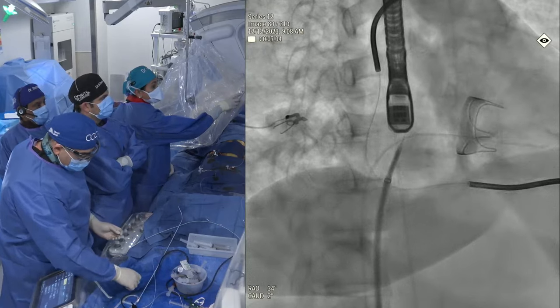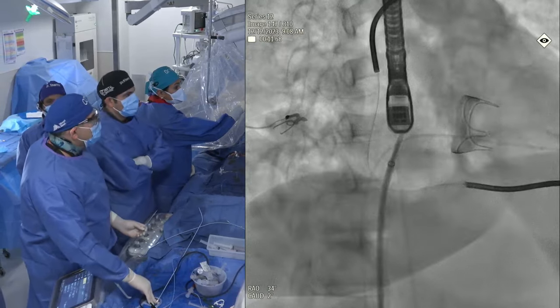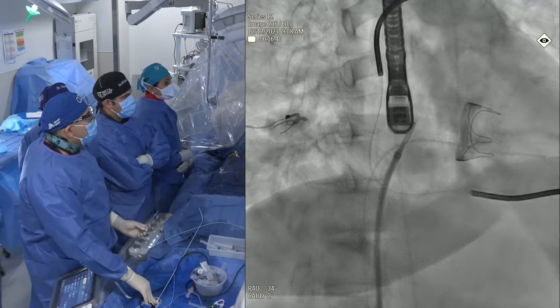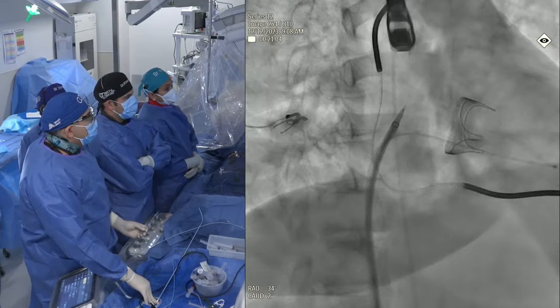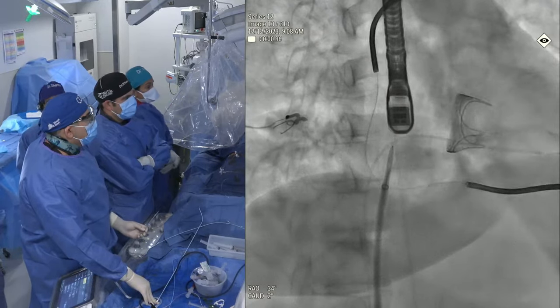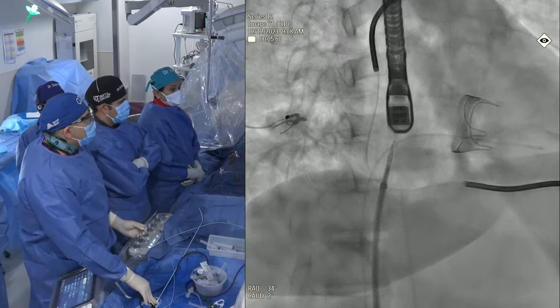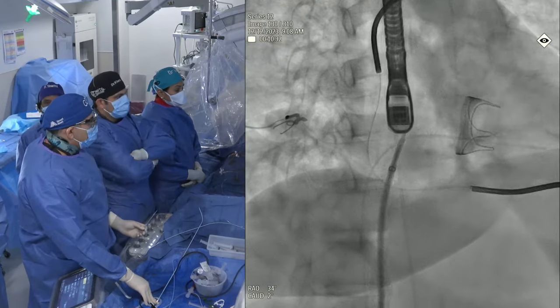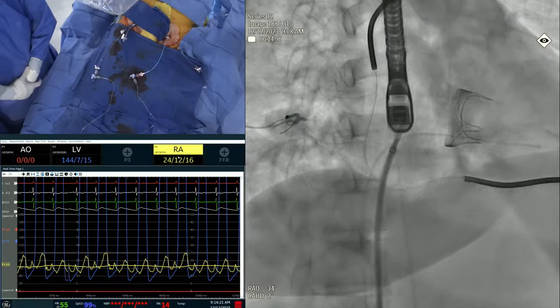Any special catheter used for transseptal or a regular radiofrequency needle? Radiofrequency needle, that's it. And you slowly advance it. So that's where you are now? Yeah, we have it. We initially gave 2000 heparin while doing the transseptal, and now we have given full anticoagulation. We'll check an ACT. We are across. And show the hemodynamics on one side also, please, in the bottom. So that's EDP and LA pressure.